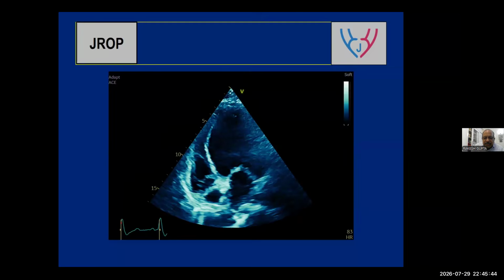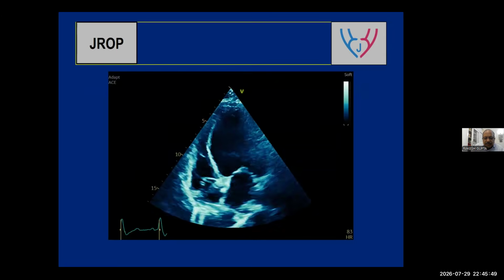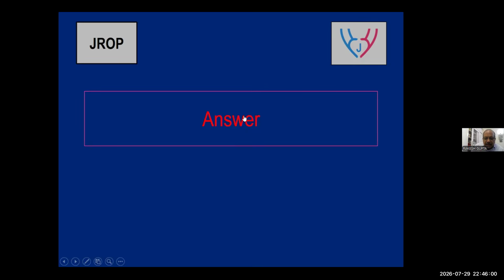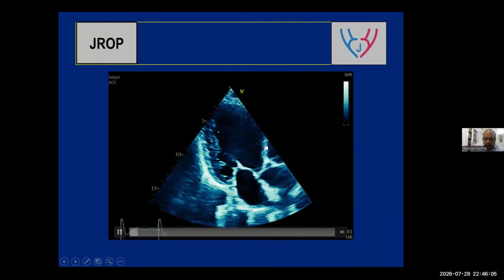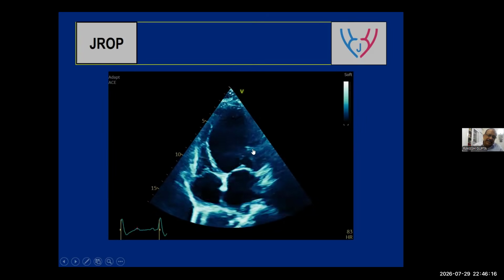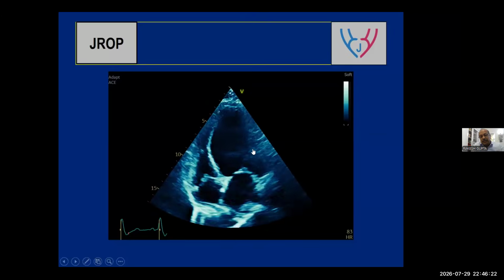Next important thing in this patient is what we said. Mid and basal septum, correct? Yeah. Then apical segments. Those look to be more of an LAD territory. LAD with RCA. And why this possibility is said is that if there's a dominant RCA or circumflex, it can go and supply the septum also.